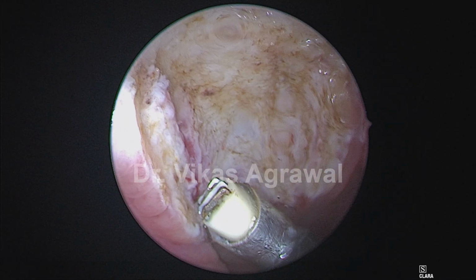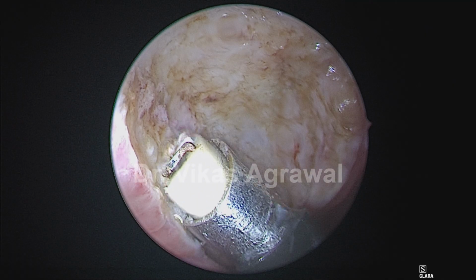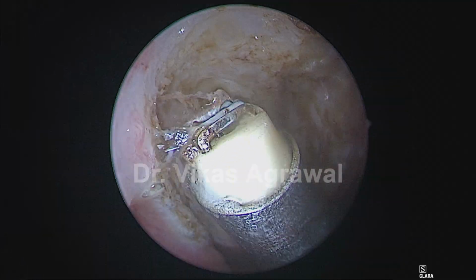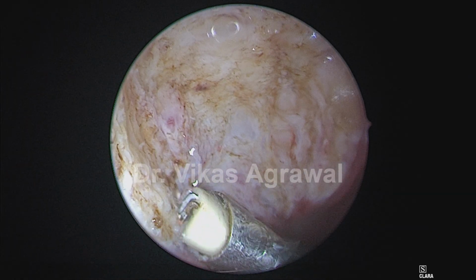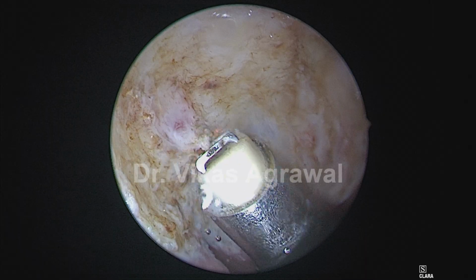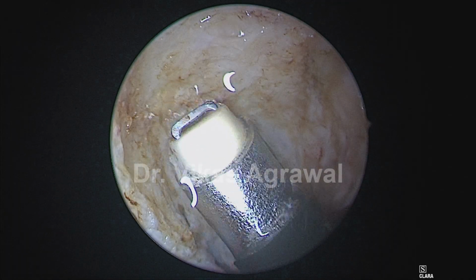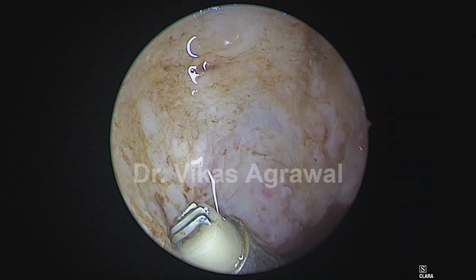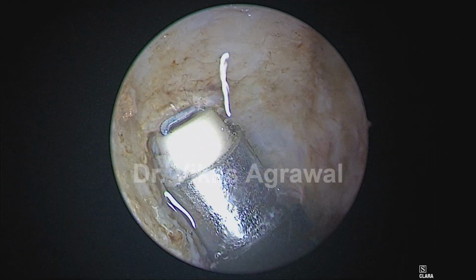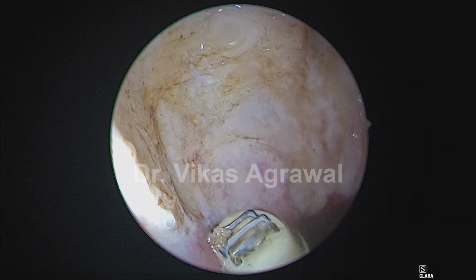You can coagulate, you can ablate. Since I can see the lymphoid tissue very clearly, I am ablating the lymphoid tissue. That's the torus tuberous lymphoid tissue already ablated. If you are not sure, you can coagulate. But here I am very sure, so I have ablated. Now, as you follow this behind, this is the lateral boundary posteriorly, which is the fossa of Rosenmuller. This is the lymphoid tissue in the fossa of Rosenmuller. So this much tissue is actually left behind after the routine adenoid surgery, which I am cleaning from all the boundaries.